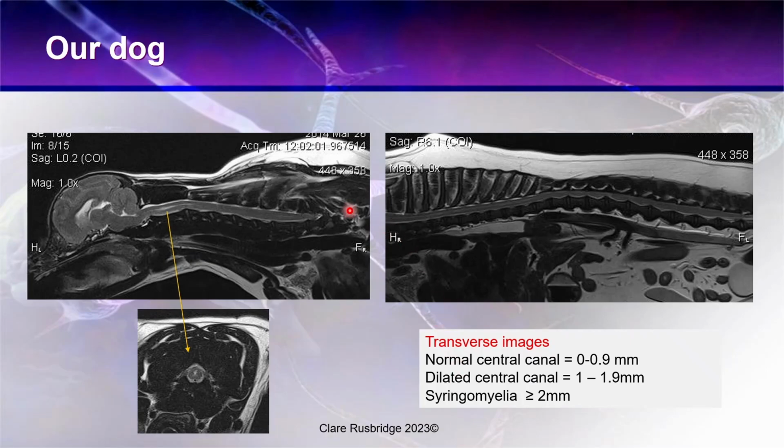Here it is. So I have imaged pretty much the whole spine. I haven't actually gone down to the lumbosacral region, or at least shown it for you, because mostly when there is a syringomyelia, it will occur in this region, not in this region. We'll also see the sites which we talked about in our pathogenesis of syringomyelia video. The sites in a Cavalier King Charles spaniel is to develop here, and then develop in this region here where there is spinal curvature.